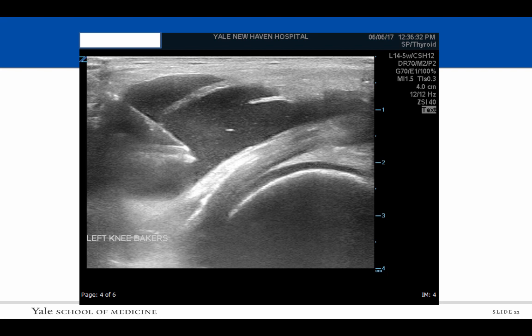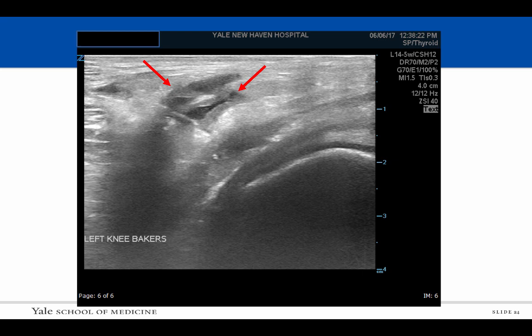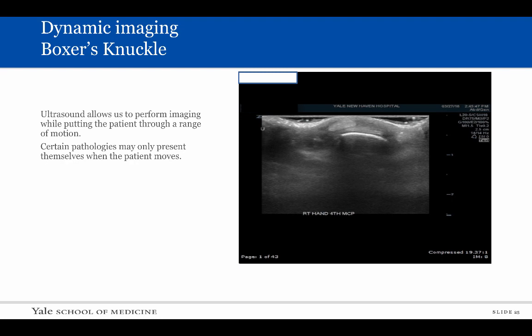This patient had a fluctuant mass along the posterior aspect of the knee which was a Baker's cyst. The darker areas in this image represent the hypoechoic fluid within a benign Baker's cyst. The thin red arrow shows a hyperechoic needle which we placed into the cyst using imaging guidance. On a follow-up image of the same patient, the hypoechoic area is significantly smaller because we were successfully able to aspirate several milliliters of fluid from the cyst, providing relief to the patient.